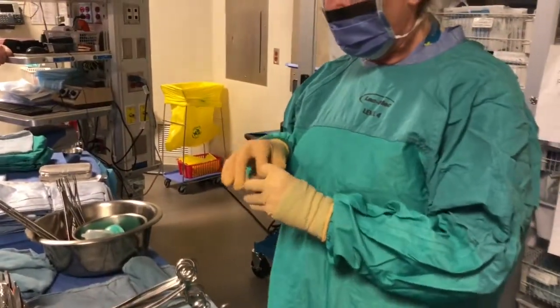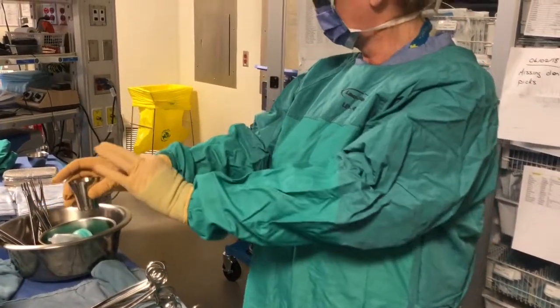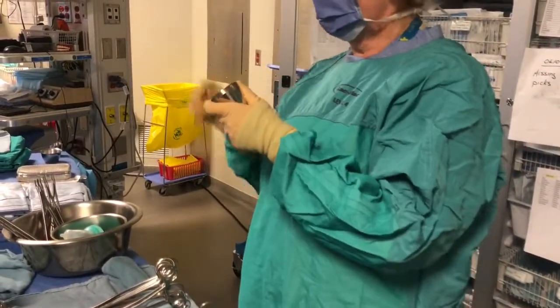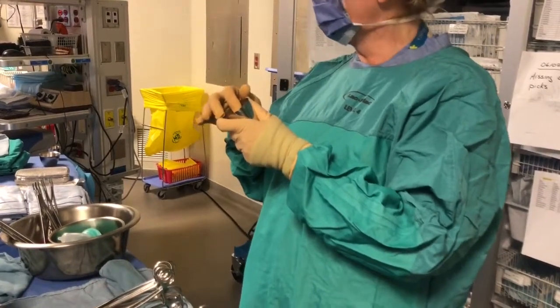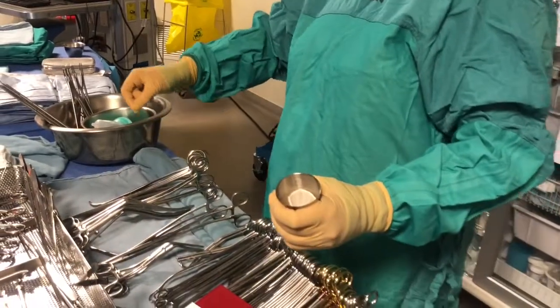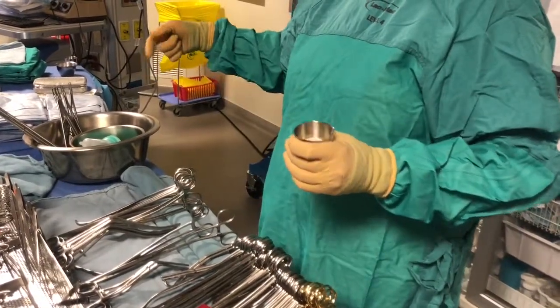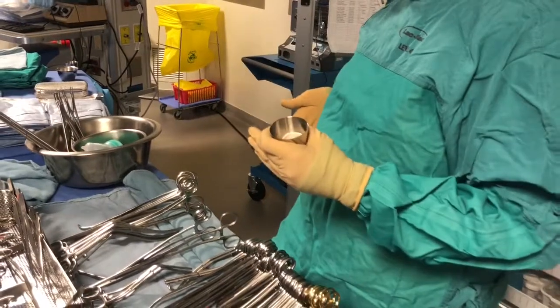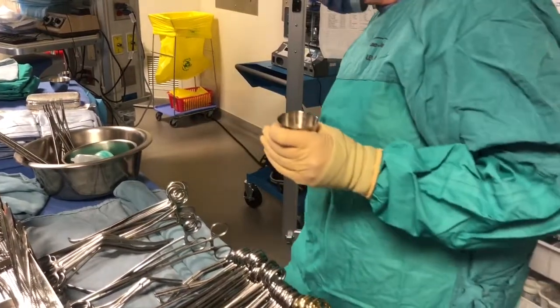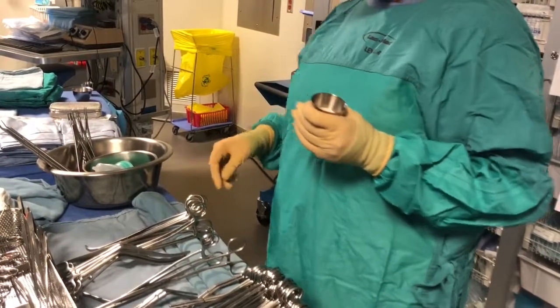What we do is, not for an aorta, but for the one where you take the vein out of the arm and you dilate it and make it bigger and you put it down into the leg, they put methylene blue in here. They pull out that vein, stretch it out, and then trace a blue line all the way down because they don't want it twisted when they go to put it in. If they see the methylene blue, they want it all straight, so they'll sew it in and make sure it's straight, because you don't want it to twist. Sometimes they don't cut all the way down to put it in. They just feed it underneath with a sponge stick.